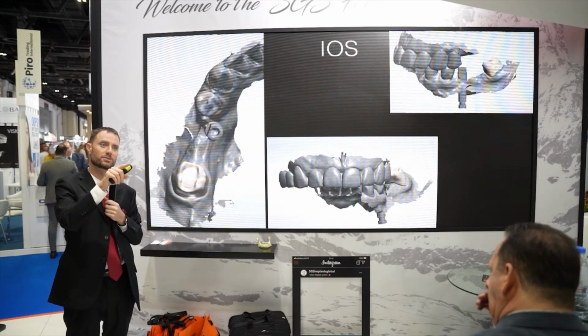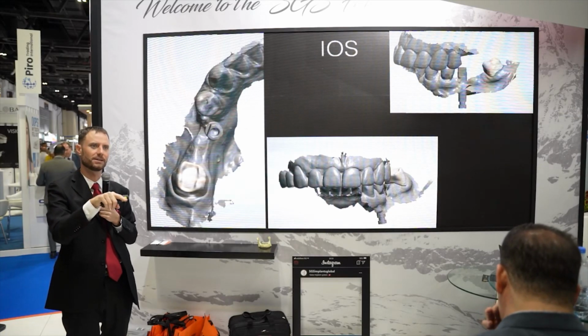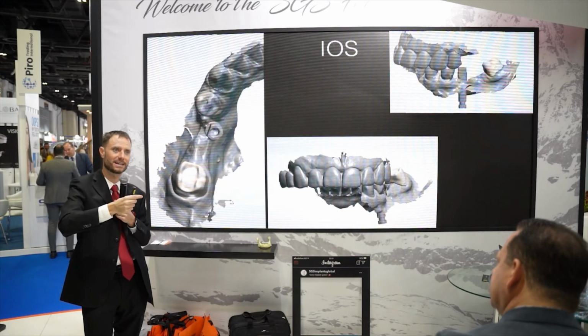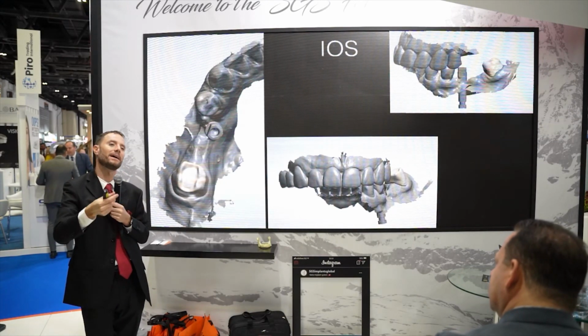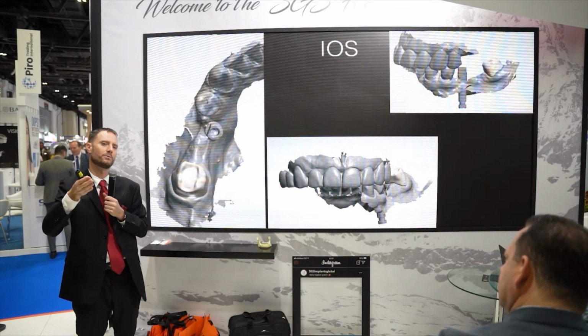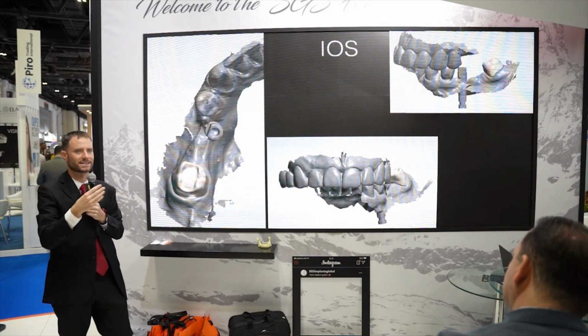To summarize, it depends on the software of your dental technician. Some software will ask you to do a double scanning, you're right. First do it without the scan body inside, just the implant purely, and then you do it with a scan body. It depends on the software. Most software will require a double scan, you're right about that. In general, what we have today is an option to go away from the dual method, and with the CBCT or the impression of the patient, you can directly go for the scanning.